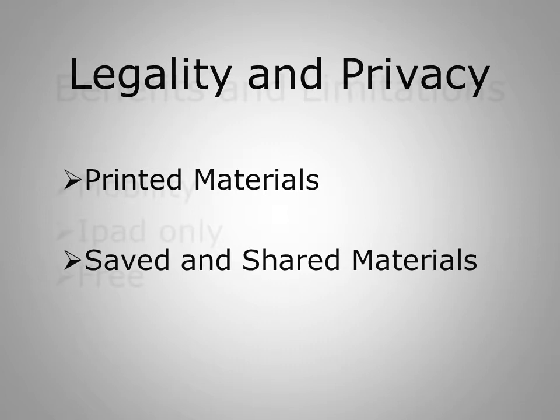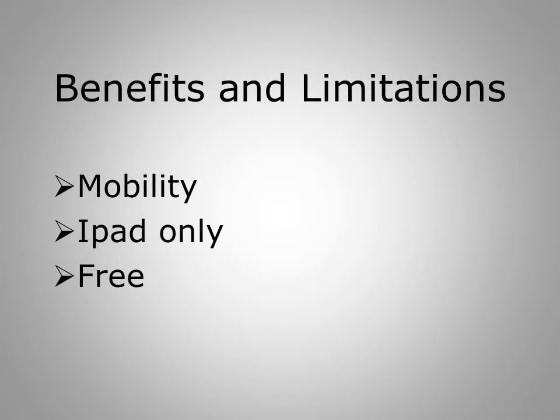This application is extremely versatile since it's available on the iPad format, which can be carried virtually anywhere. However, this fact and the fact that it is only available for the iPad limits its uses as well, considering the diversity of tablets available on the market today. Another great benefit to this application is that it's free, considering its capabilities and usefulness within the nursing profession.